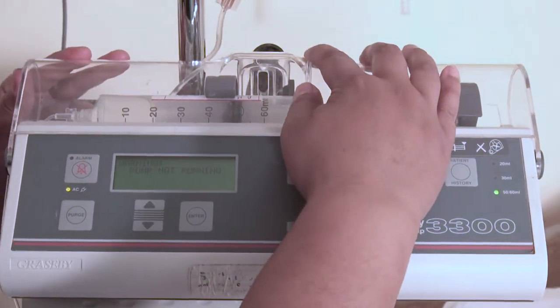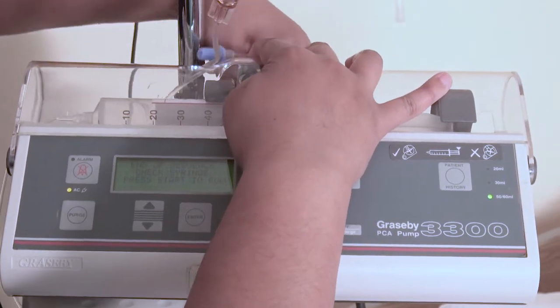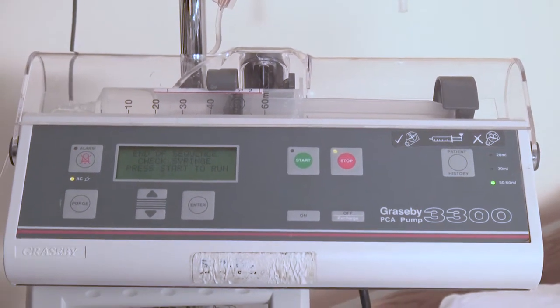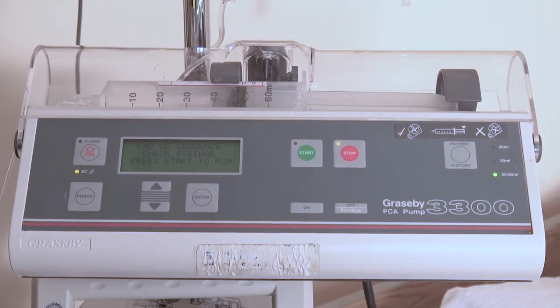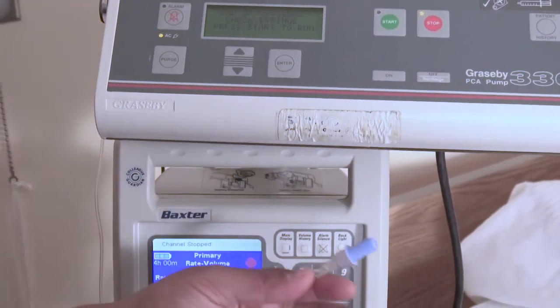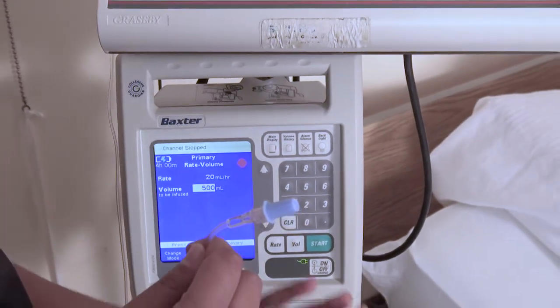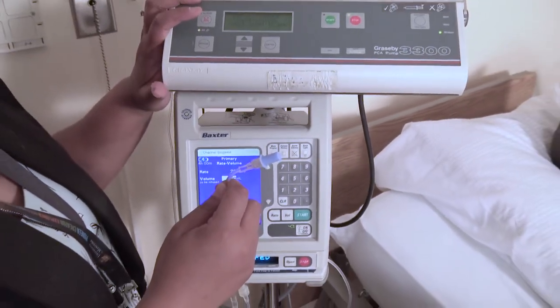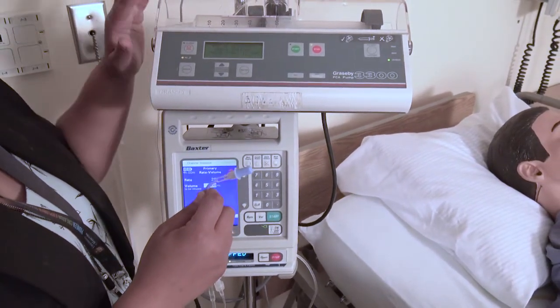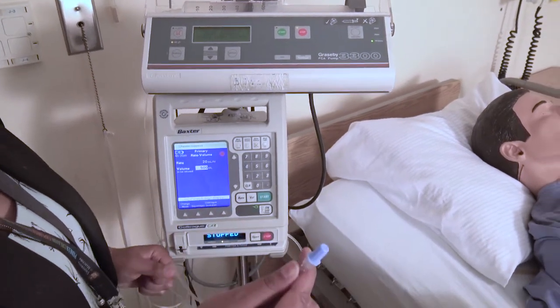So then you're going to close the cover and just lock the key, and then you could press start. But because we're not hooked up to the patient yet, we're not going to press start yet. We're going to now attach it to the patient. So now we've already done our 10 checks with our MAR checks. We've double checked the syringe with another nurse when we made it. We have another nurse double check the programming at the pump, and now we're okay to administer it to the patient.